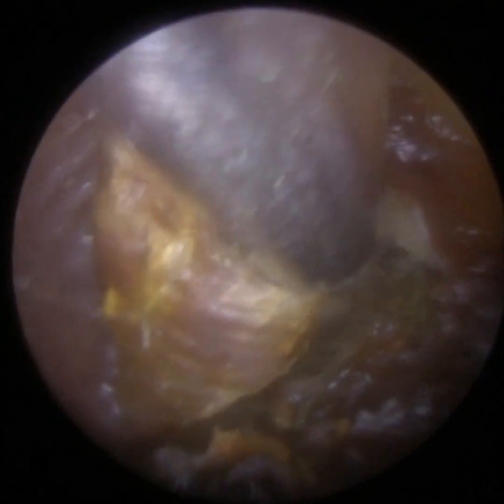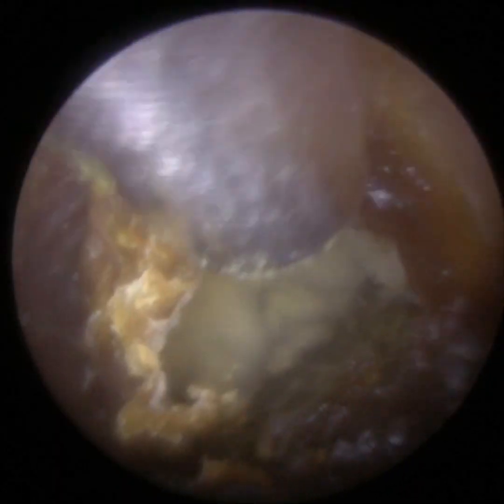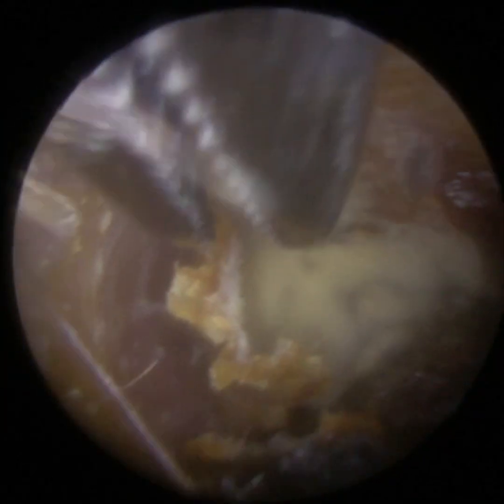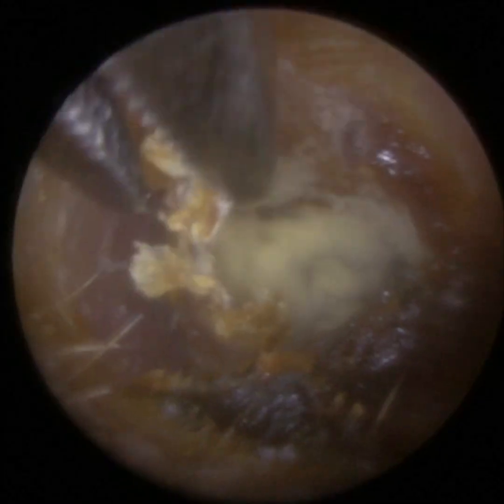If I put drops in too soon here on this ear, the skin will get a bit wilted, and when you put the forceps on it, it's just going to slice it and cut it as opposed to extract it. So what I did with the suction probe, I lifted the skin off the canal wall. So I've got a bit of space now to insert the top jaw over the skin without making contact.